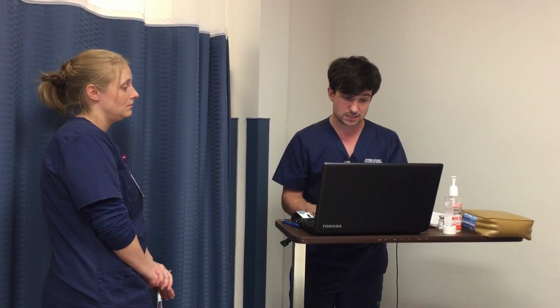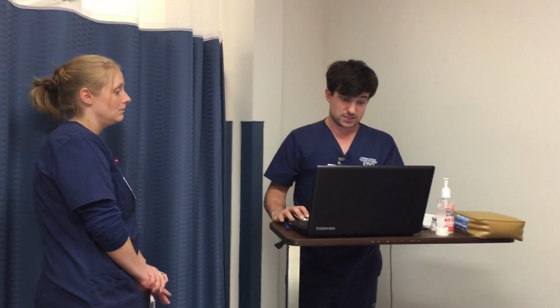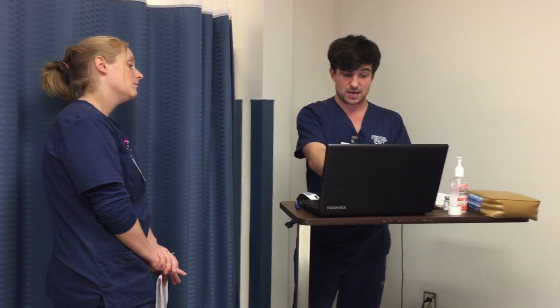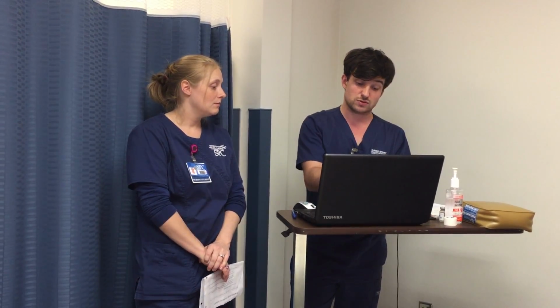So we're going to do that. We're going to check on the MAR that this insulin is within the sliding scale, which it is, and you can see that right here. It says 251 to 300. We're giving 6 units. His last insulin check was 290, so we're going to be giving 6 units of this.